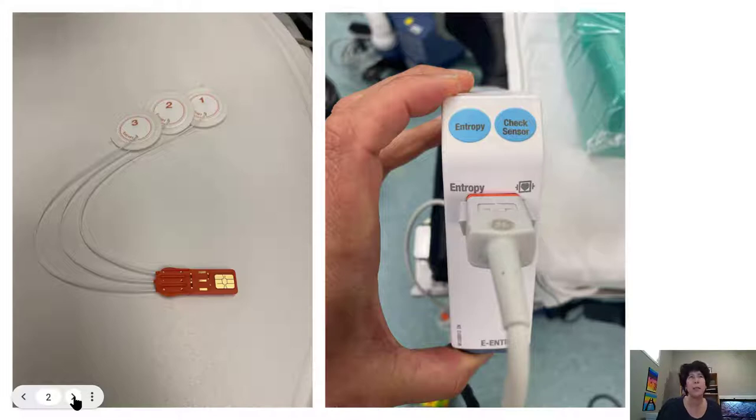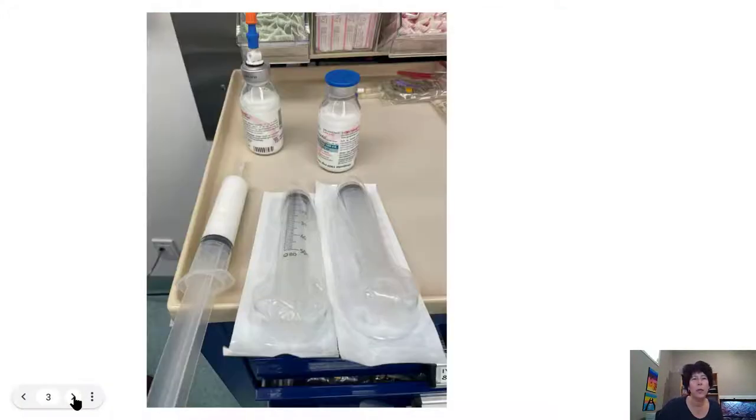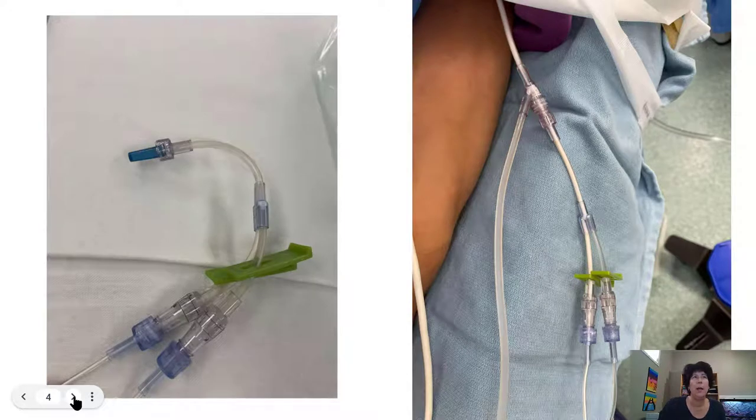Please grab some stickers to put on the patient's head if you're going to use the TCI pump. We need to be able to draw up Propofol. Unfortunately we don't get pre-filled syringes yet, although they may come in future. I would suggest having bottles of Propofol with spikes for drawing up quickly and a bunch of extra 50 ml syringes. To administer the anesthetic, you need some kind of connection to your IV or a completely separate IV. I like running combined Propofol-Remi using Y-sets that go into the proximal approach to the patient.